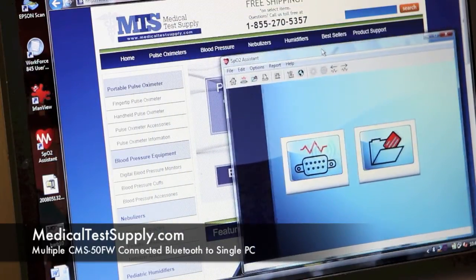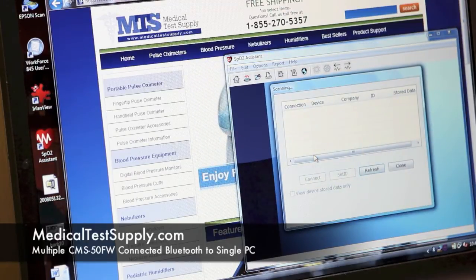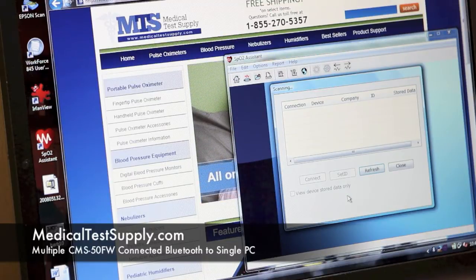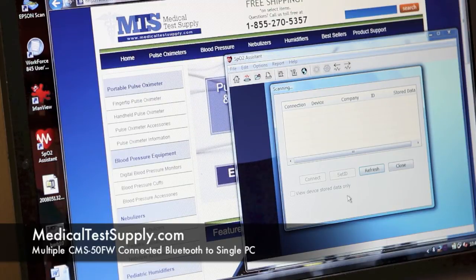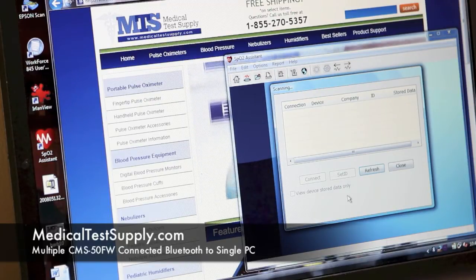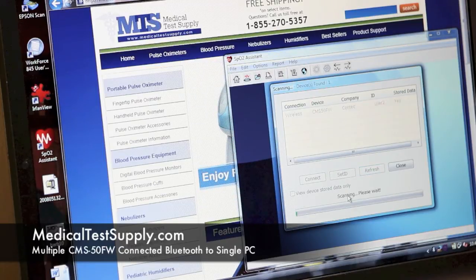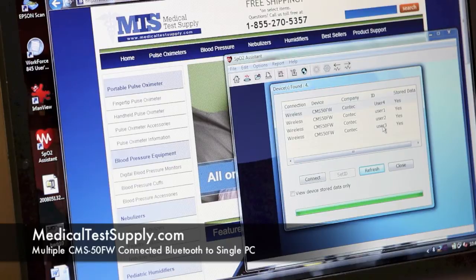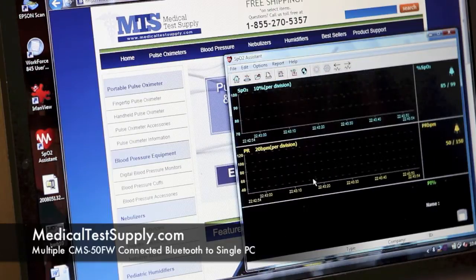First we'll open SP02 Assistant and connect device — it'll scan for Bluetooth devices. You can see here it's picked up CMS50FW user 1, user 2, user 3, and user 4. We'll select one and connect.